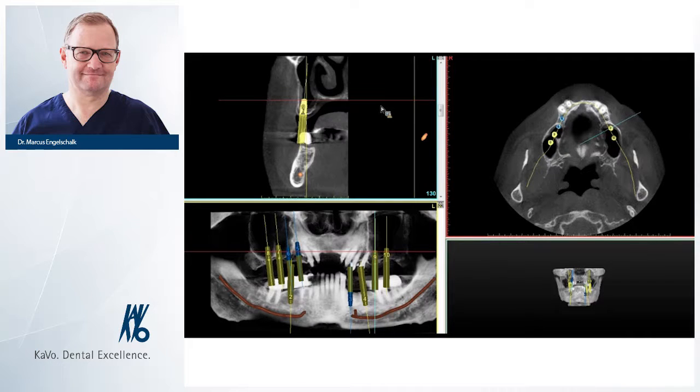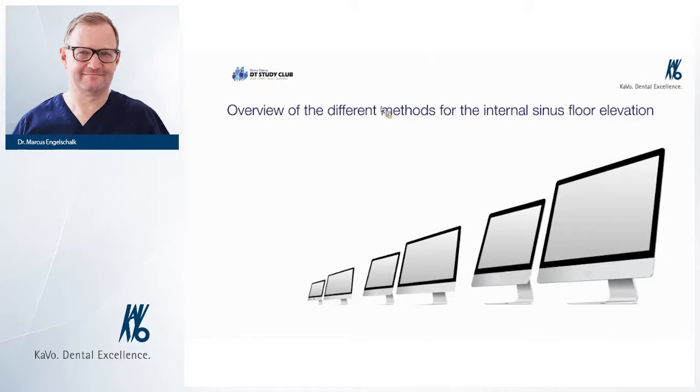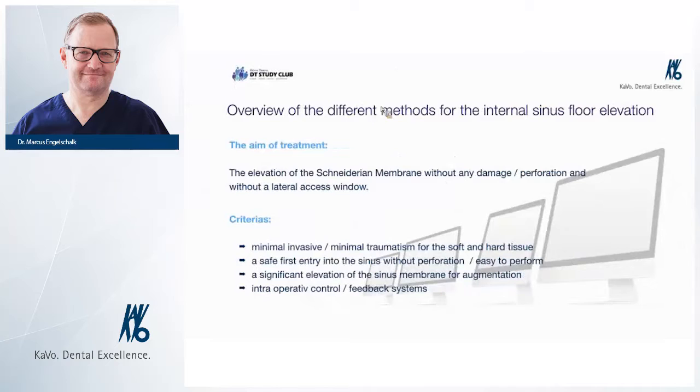Well, first we saw the septums. Now what can we see on this side of the same cone beam? Well, it's very easy because we can now measure the height of the residual bone. So this is important to decide: will you perform implant placement and augmentation at the same time, or should the bone or the augmentation heal first and then you bring your implant in?